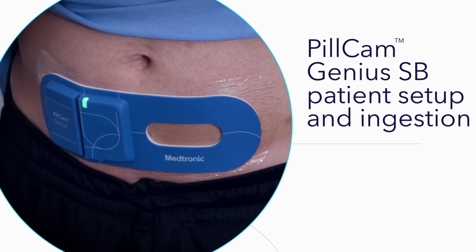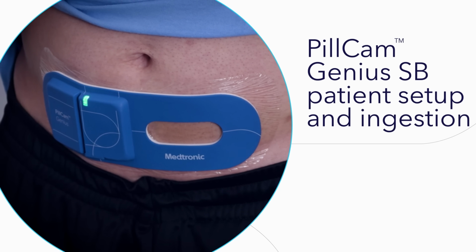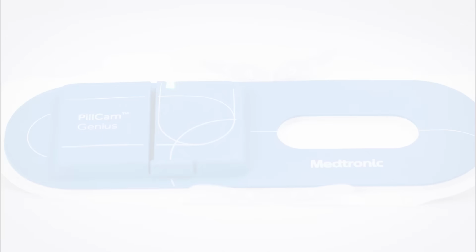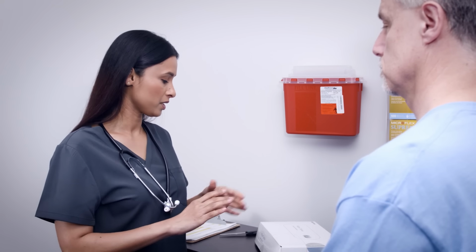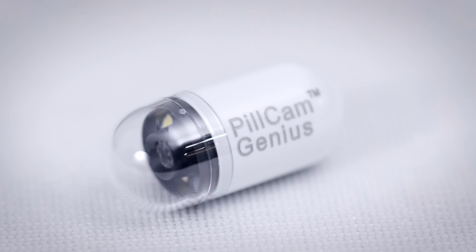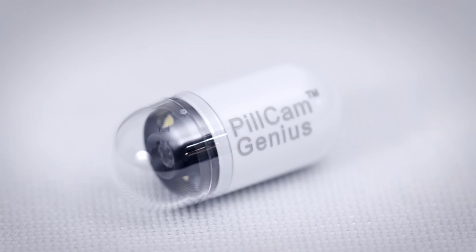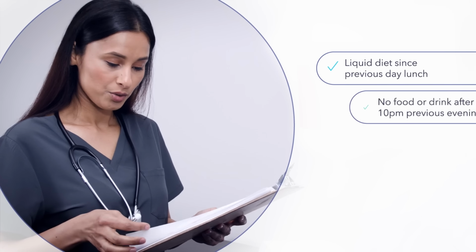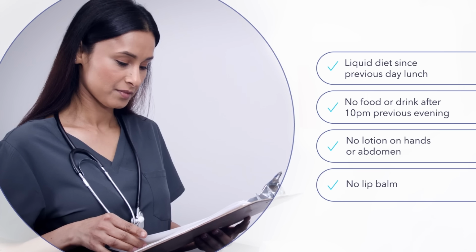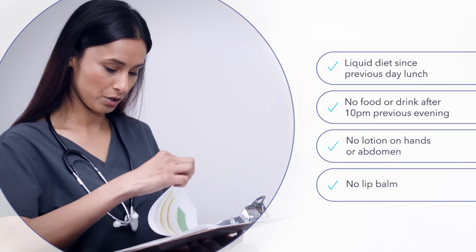Your patient is here for a capsule endoscopy with the PillCam Genius SB Capsule Endoscopy Kit. The first step is to apply a PillCam Genius link device to the patient's lower abdomen. This will be worn for the duration of the procedure. Then, the patient will ingest the PillCam Genius SB capsule that will take pictures of the small bowel as it moves through the digestive tract. Before you begin, confirm that your patient has followed pre-procedure instructions.